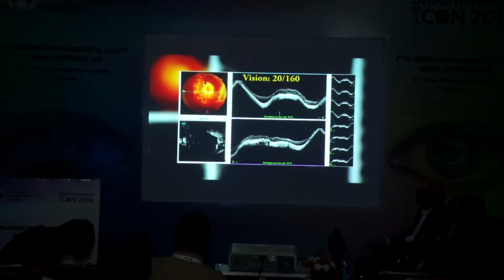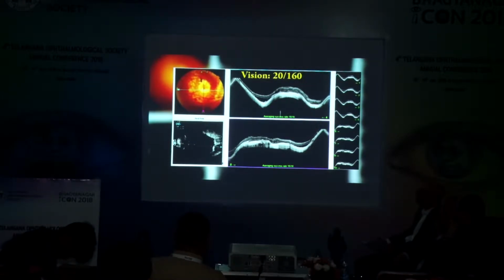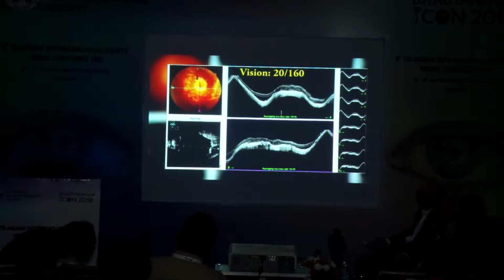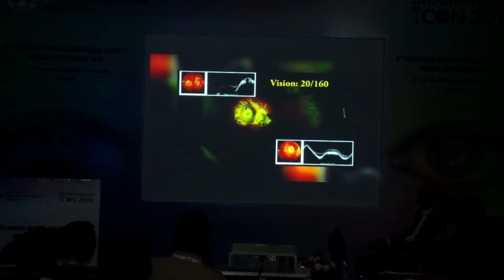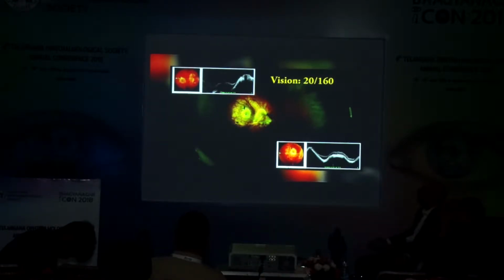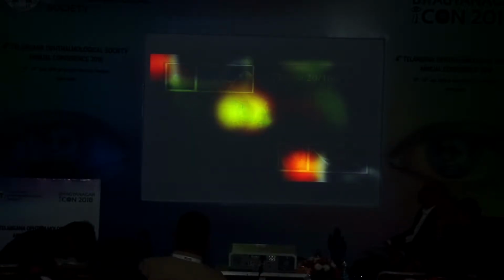with successful closure of the macular hole and resolution of retinal detachment. The OCT and B-scan ultrasonography images show a proper indent with the retinal detachment completely resolved. Macular buckle surgery counters the pulling effect of the posterior staphyloma and restores the functional vision in highly myopic patients, provides good anatomical and functional outcome, and solves the mystery behind the treatment of such detachments.